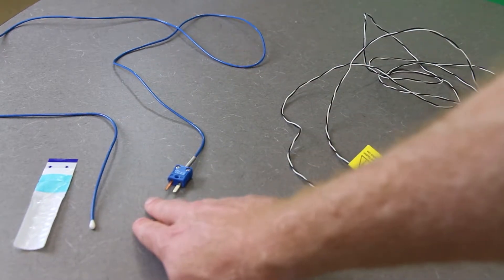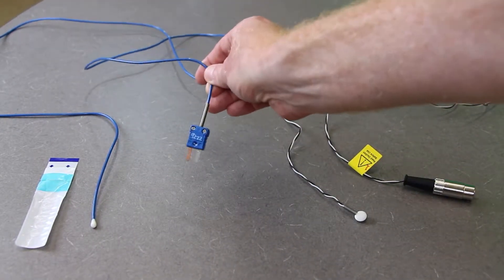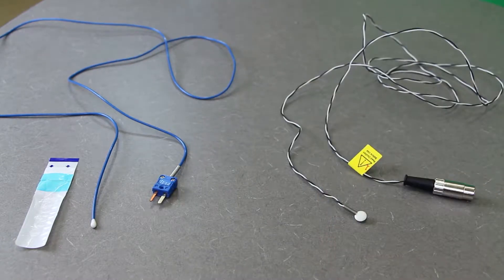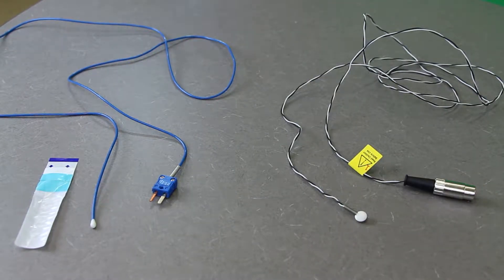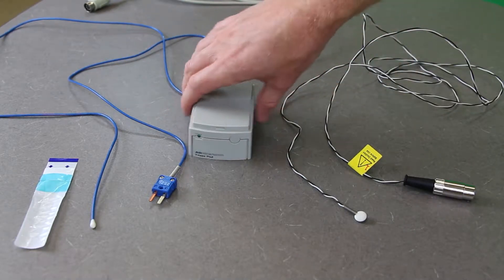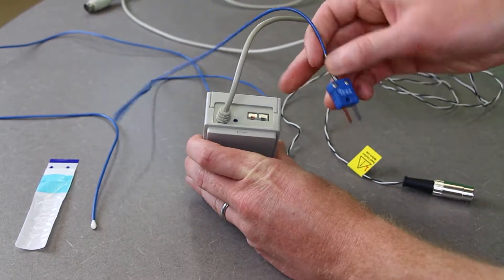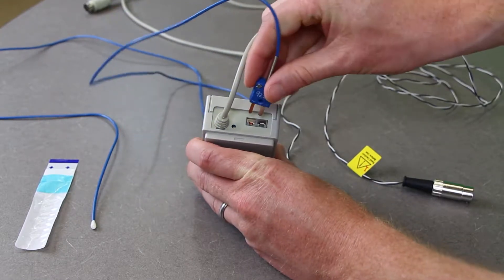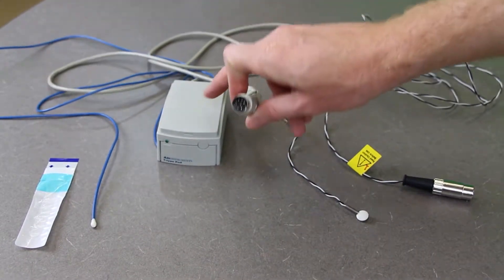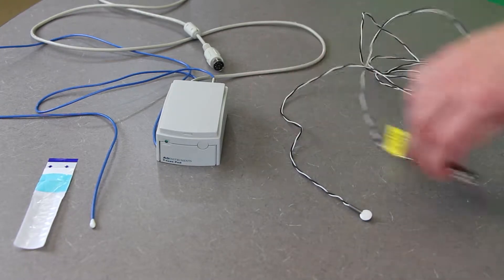The blue one here with the white tip is the rectal temperature thermometer — this is how you're going to get core temperature. It has a very different type of adapter for plugging it in; it actually has to go through a special pod, a temperature pod or T-type pod. You plug it in — there's a copper and a silver prong — and the other side of this T-type probe adapter has a DIN pin just like the one on the skin temperature probe.